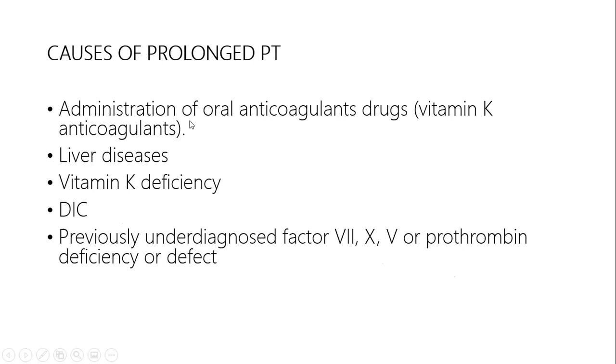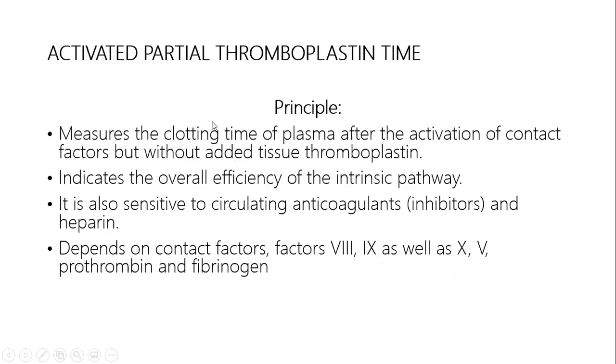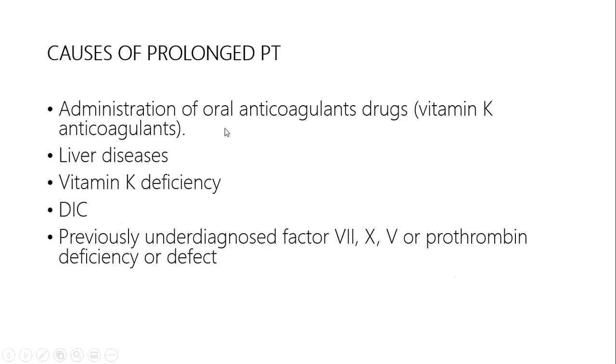So if the PT of the patient is 20 seconds, then we might suspect that the patient is undergoing some anticoagulant drug therapy. The patient might be taking oral anticoagulant drugs, and we know that these anticoagulants might affect the function of your vitamin K dependent proteins.